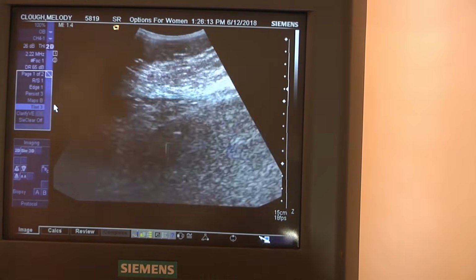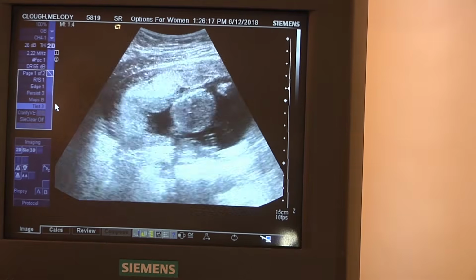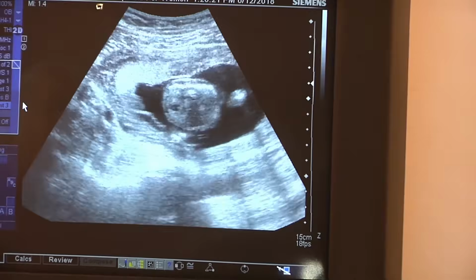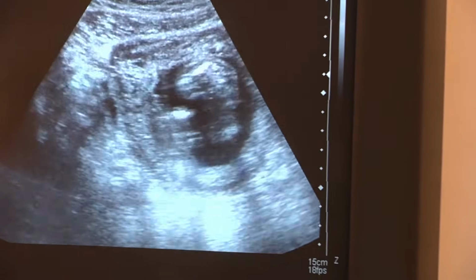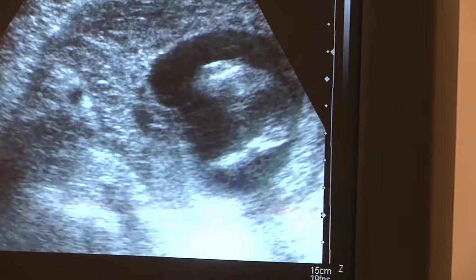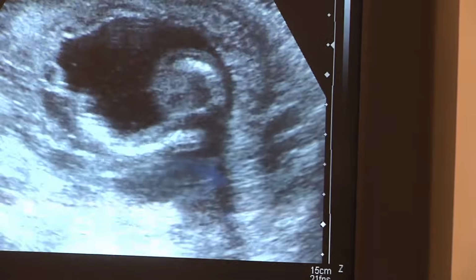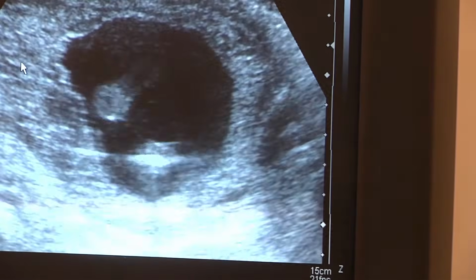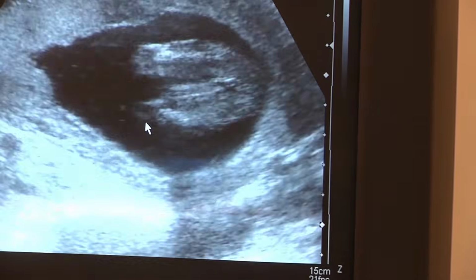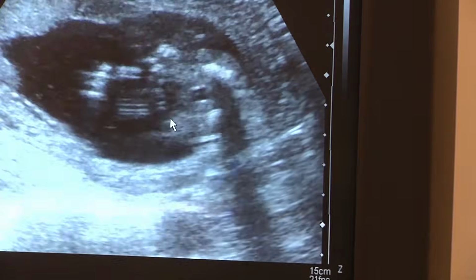Okay. Now, just so you know, to get the babies live for the sex, go 90 degrees, same way. Go to the head, travel down the body of the baby to in between the legs. And then you want to zoom up. And you just don't want me to see, do you?